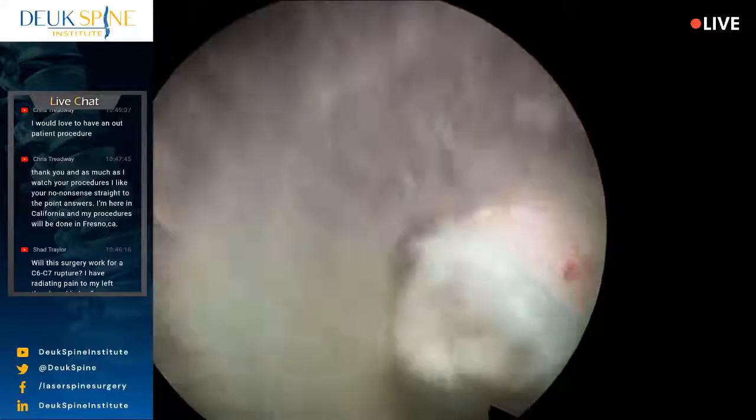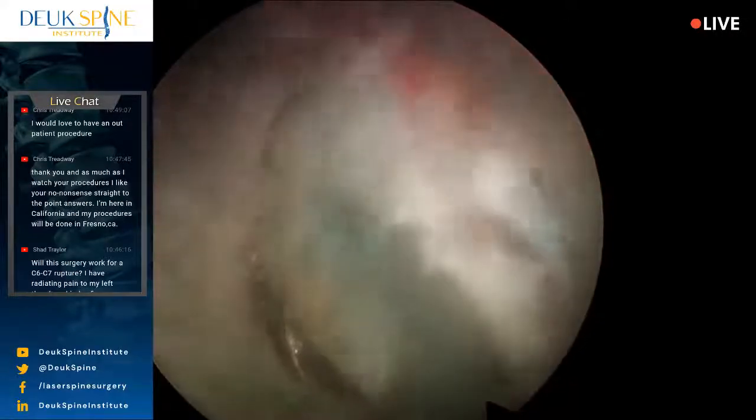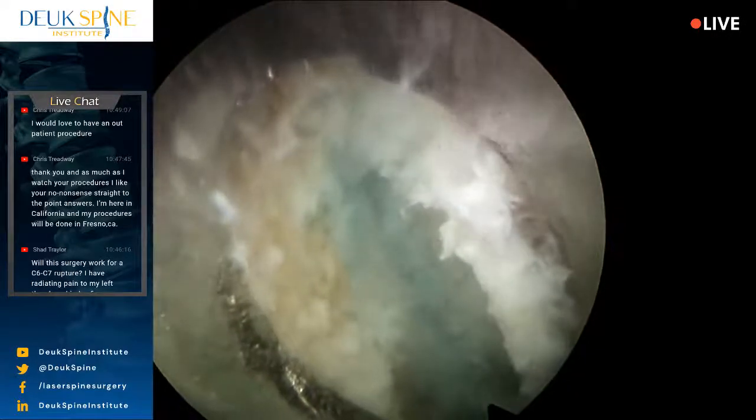All right, that looks like the nerve right there underneath that little bit of fat. And that would be the patient's right L4 nerve root. We're done.